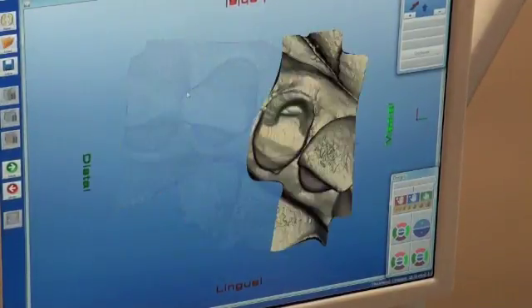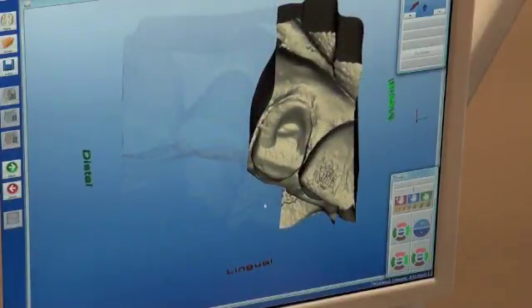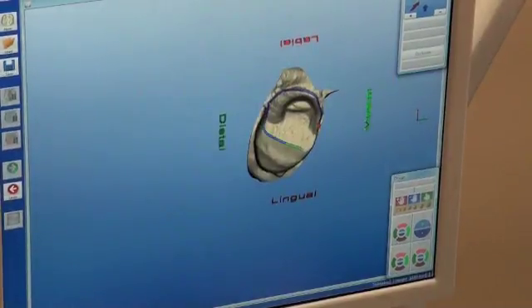These margins or edges represent the seal, where the veneer will meet tooth structure. The seal is very accurate, specifically to 50 microns, or 0.05 mm.